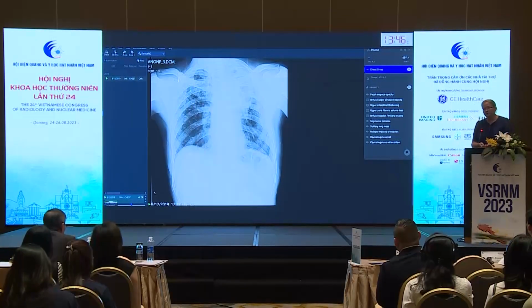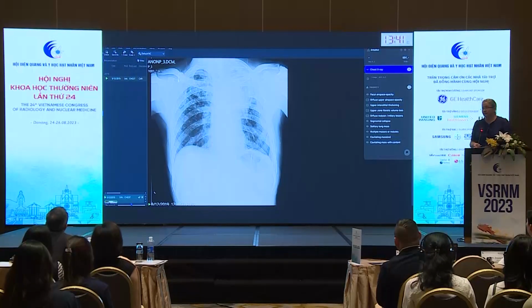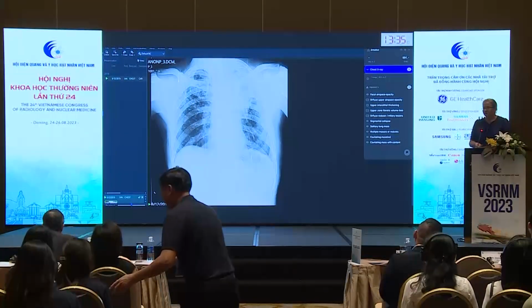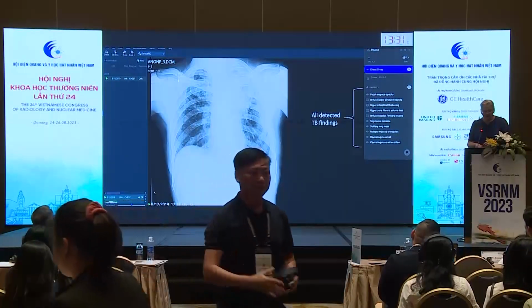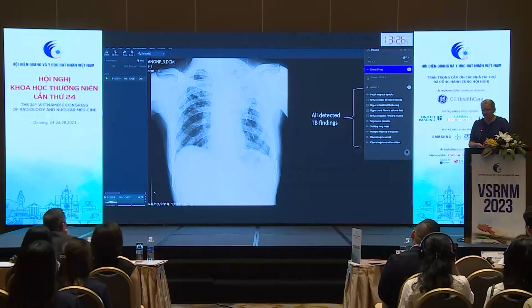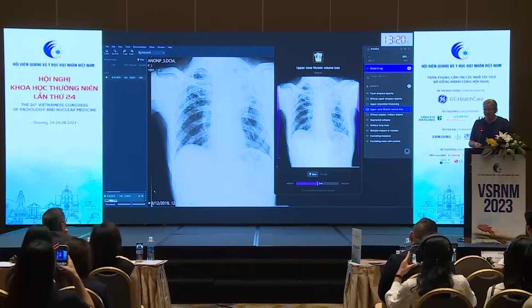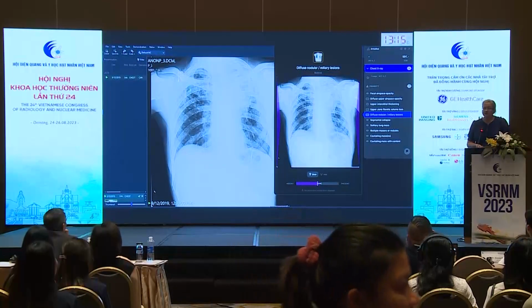Now, I know lots of the questions we have here in Vietnam relate to TB. And there's going to be a talk coming soon about TB, which I'm looking forward to hearing. But we have a lot of findings that are relevant to TB on chest X-ray. These are all of the relevant findings that we can include to talk about TB. And we can demonstrate where the opacity is, we can demonstrate the fibrosis, we can talk about the miliary lesions.